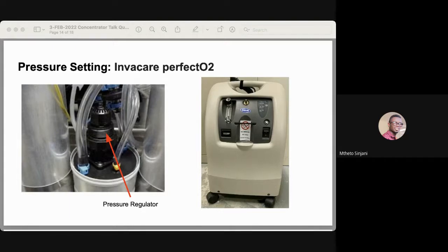Turn the pressure adjustment screw clockwise in order to increase the output pressure, or turn the pressure adjustment screw counterclockwise to decrease the output pressure. Adjust until the pressure reads a steady 4.5 to 5.5 psi, and then allow the concentrator to run for 10 minutes. You can retest the pressure by performing the mentioned steps to ensure there is proper operation. Once the pressure is achieved, you can reinstall the cabinet.